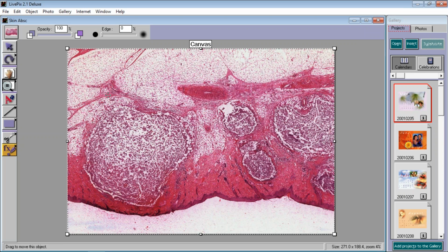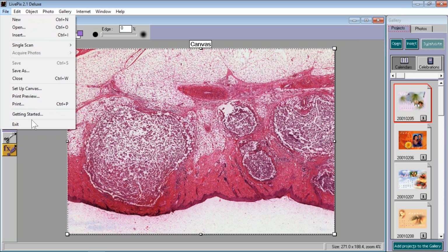And then it also extends just about right into the subcutaneous fat as well. So let's make a very honest diagnosis here and just call this abscess in the skin, or abscess in the dermis, or pus within the abscess material, okay? Or the pus is the abscess material.